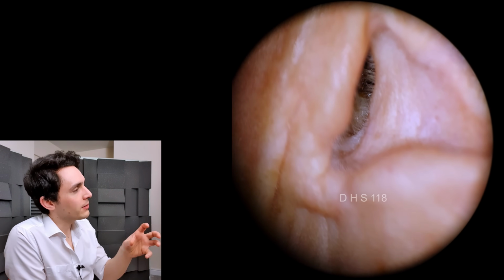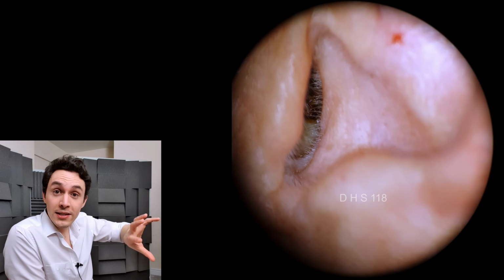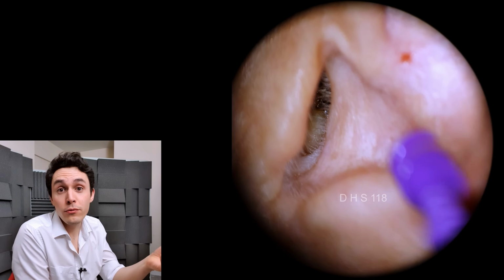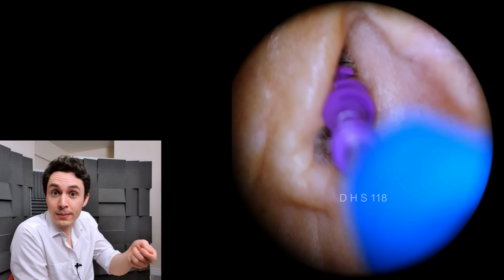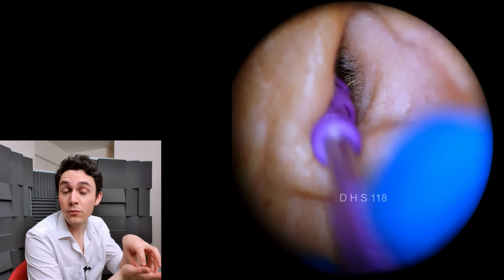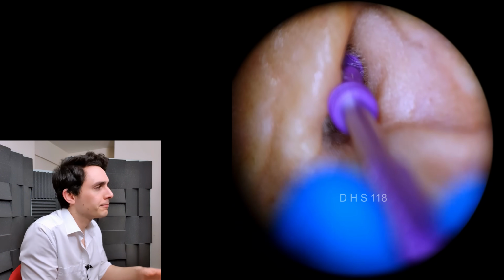And what happens is, as you're turning it, the wax that it's enveloping and spiraling around will get caught in the flutes of the helix, and then once you've achieved the appropriate depth, you can gently pull it out, and the wax that's been caught on the inside of the spiral will then be removed in one chunk. That's the theory anyway.